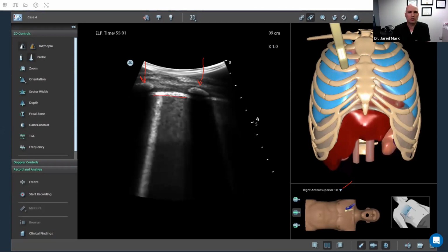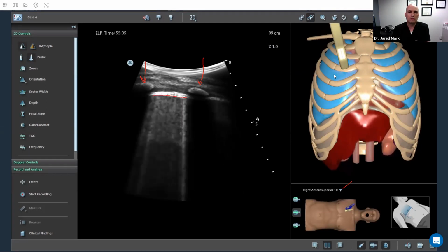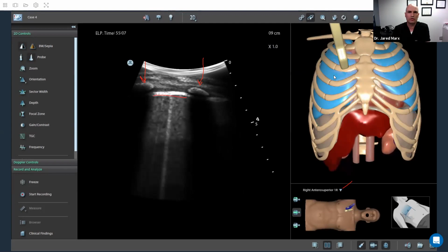It's a finding that you can see in many pathologies in the lung, but it's one of the findings we see even in mild disease of COVID. And it's important to be able to recognize that because X-rays will not always show it, and this will be more sensitive and show up earlier than an X-ray. So teaching this skill is helpful to our learners.